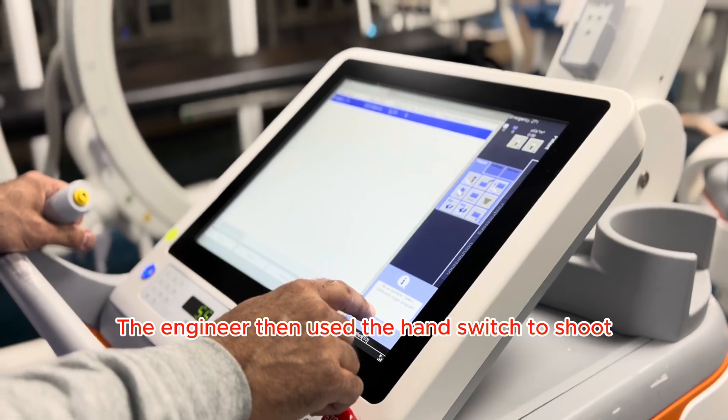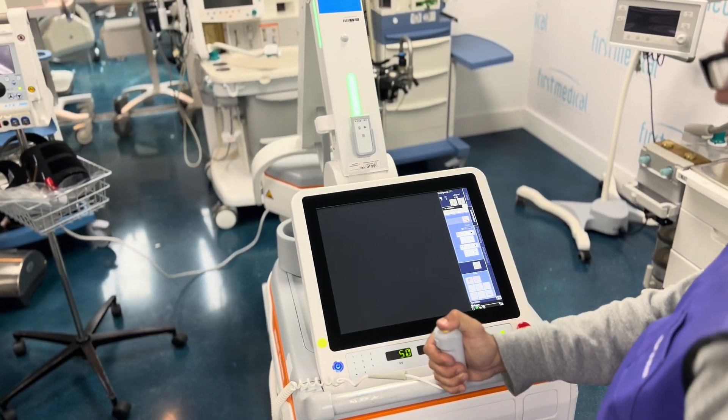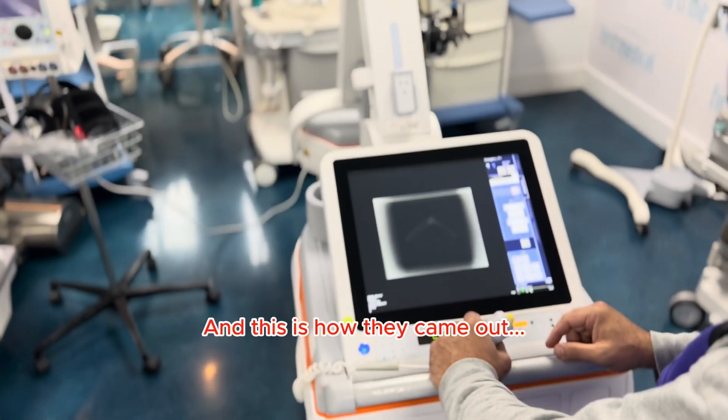The engineer then used the hand switch to shoot multiple x-rays of the phantom in different positions. One can also use the remote control it comes with. And this is how they came out.